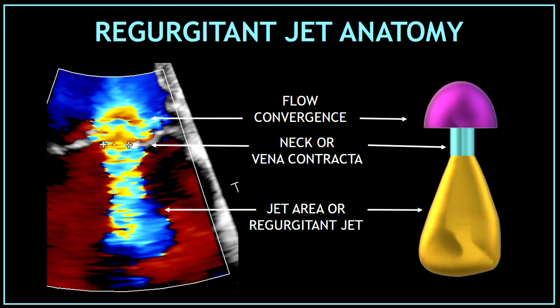We have to recognize all the segments of the regurgitant jet anatomy in the echocardiogram. On the left, we have a picture of a mitral valve regurgitation, and here we can see all three segments of the regurgitant jet anatomy. From top to bottom: the first segment is the flow convergence, the second part is the neck or vena contracta, and at the bottom the third part is the jet area or regurgitant jet. All segments need to be present when measuring the vena contracta.